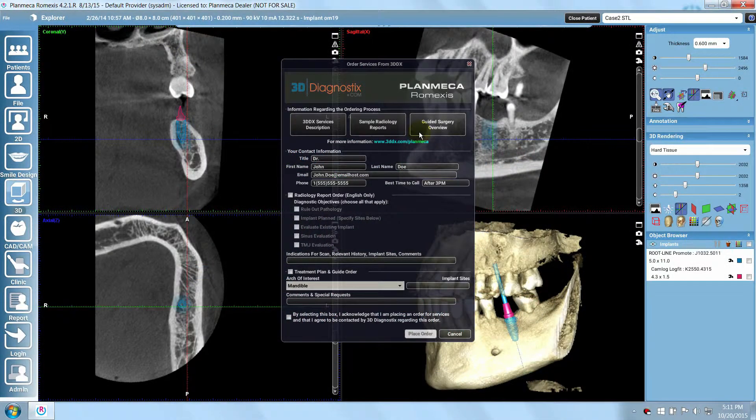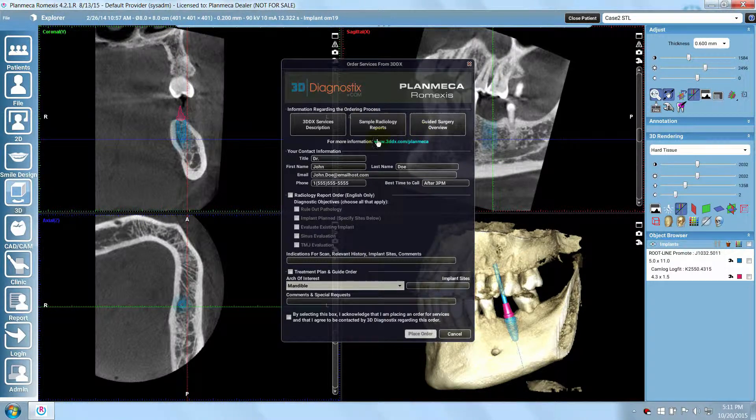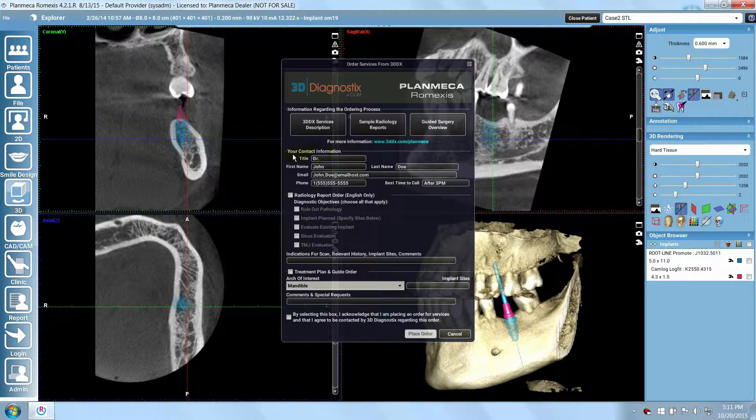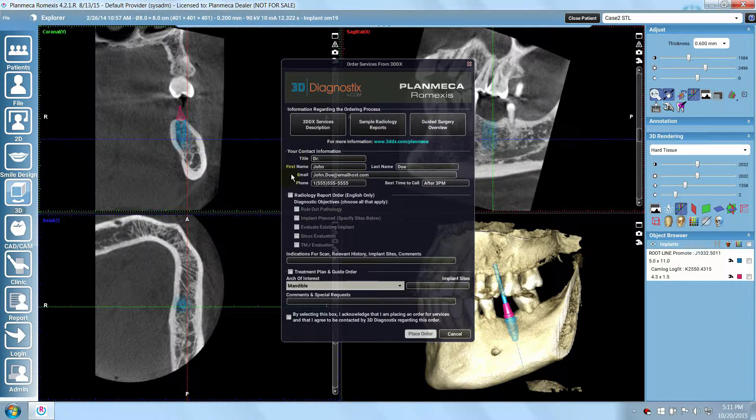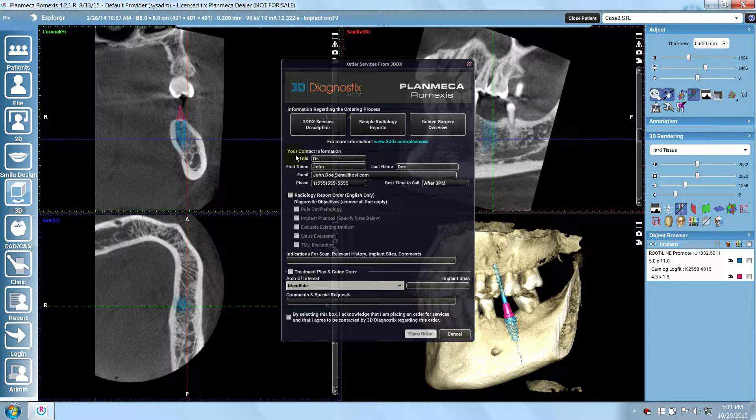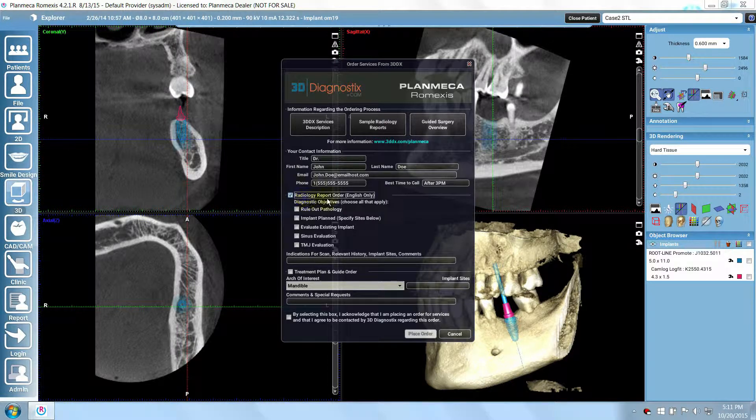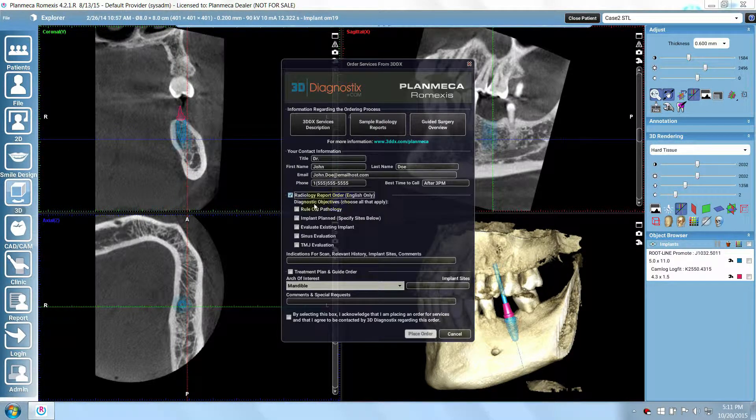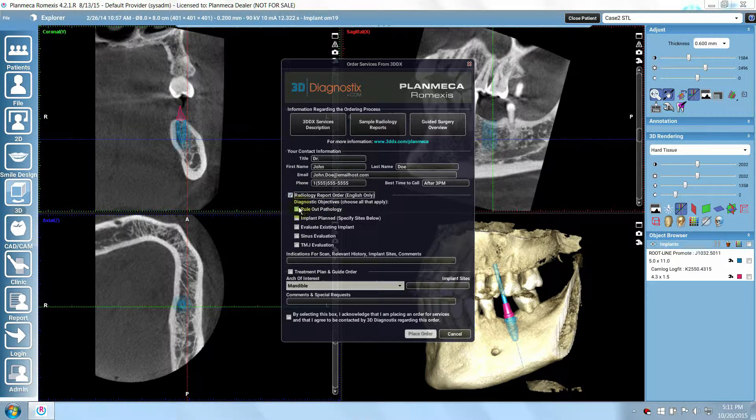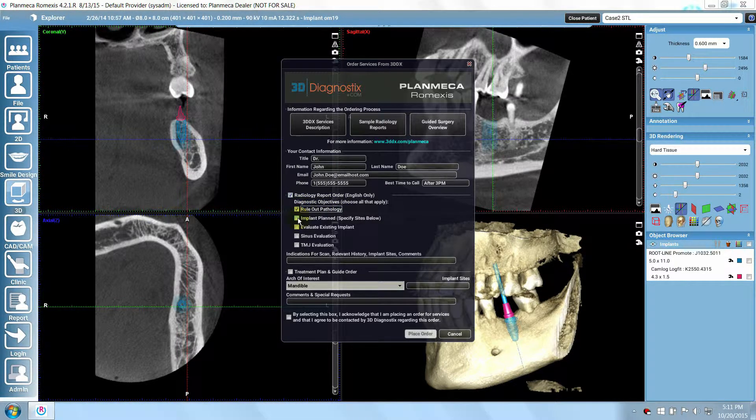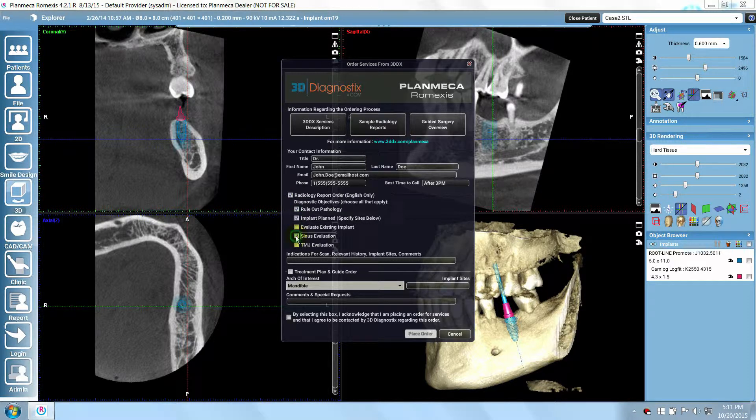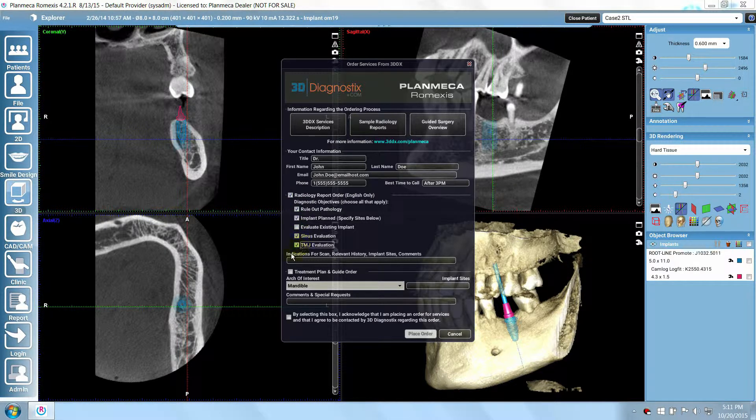Enter your contact information, then select the options from the list of order options. If you want a radiology report only, or you want a radiology report with your order, then check the Radiology Report Order checkbox. Select which diagnostic objectives you want, checking all that apply.